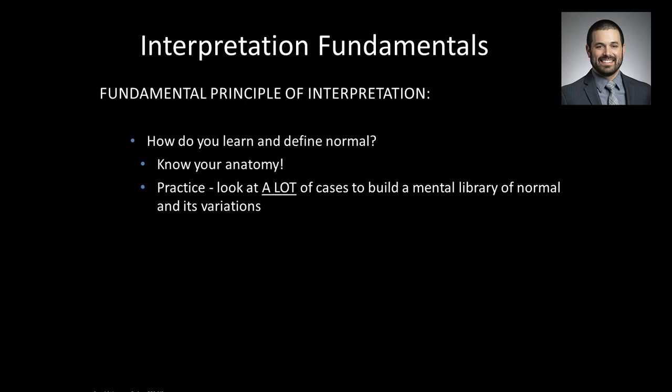Remarkably, what happens is even if you didn't study the specific signs of a certain specific disease, if you've looked at enough cases, eventually something will pop into your brain and say, huh, that's not quite normal. What is that? I'm going to look at that further because it's going to be 2 to 3 standard deviations different than the 3,000 cases you've seen prior. Your brain will passively flag it and bring it to your attention.